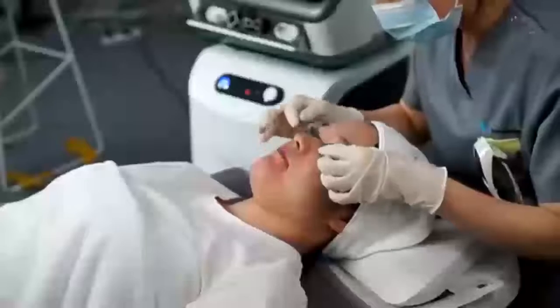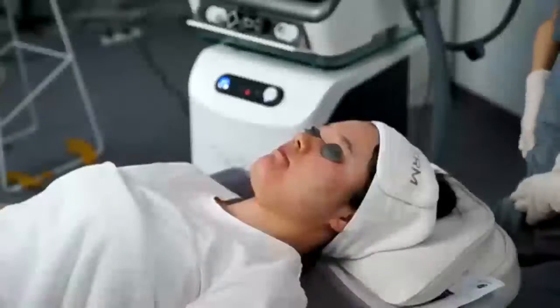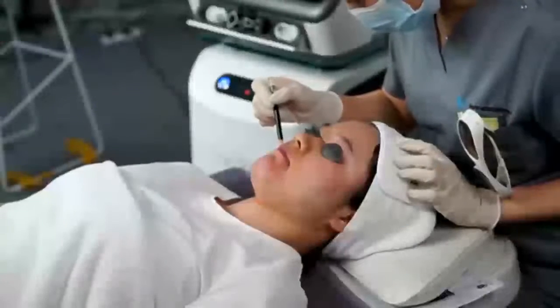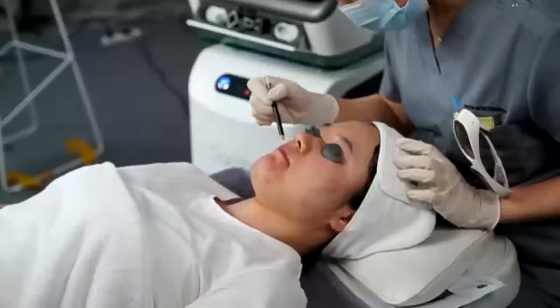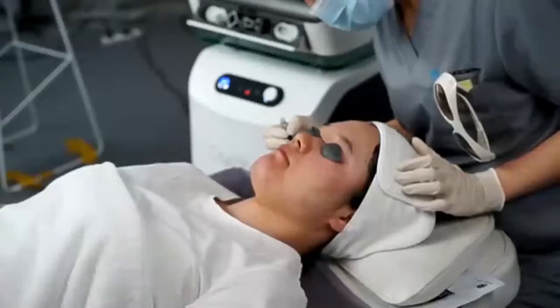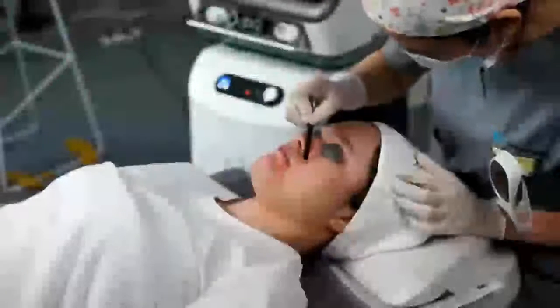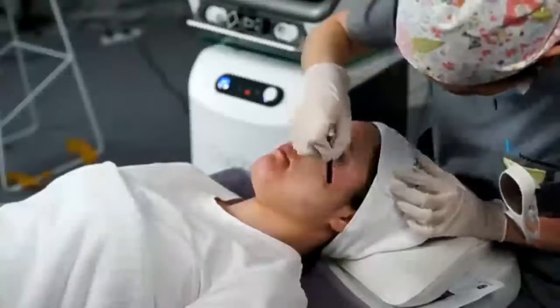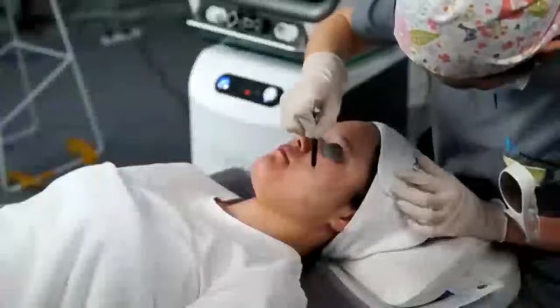OK, the surface treatment has already been done, and then we first mark the key areas of her face. We will use the mark pen to mark the most serious parts on her cheeks. On the cheeks, there are 2 areas where the pores are relatively large. Her cheeks have 2 parts where the pores are very large. And the other 2 parts have very serious acne scars.